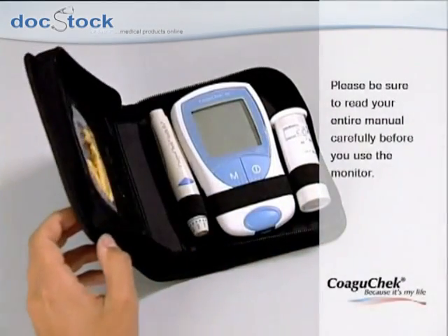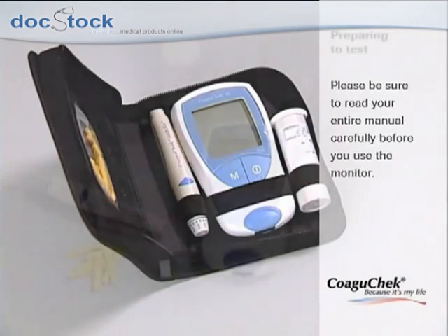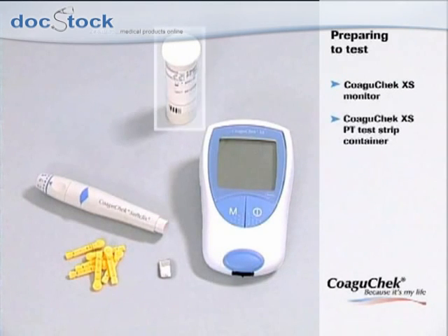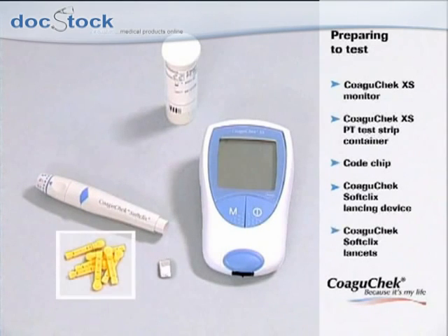Please be sure to read your entire manual carefully before you use the monitor. Let's start with preparing the test. Please have the following items nearby: the COAGUCHEC XS monitor, the COAGUCHEC XS PT test strip container, the code chip belonging to these test strips, the COAGUCHEC SoftClicks lancing device, and the COAGUCHEC SoftClicks lancets.